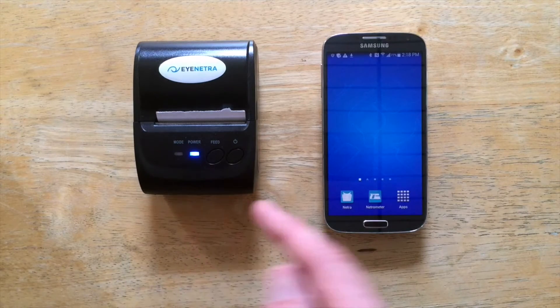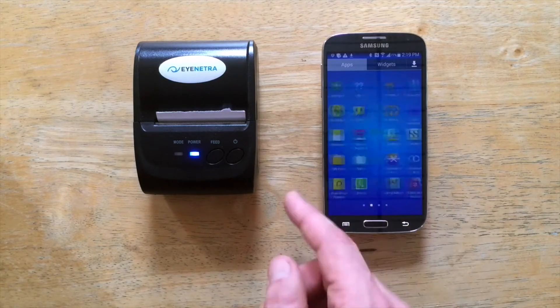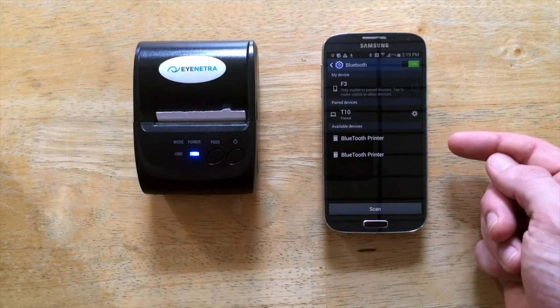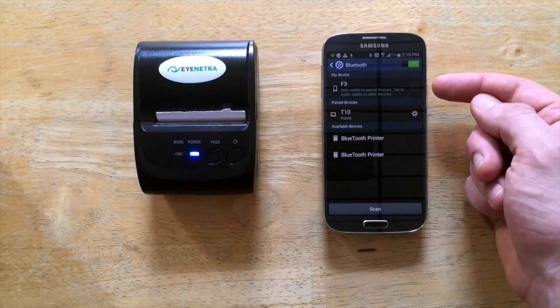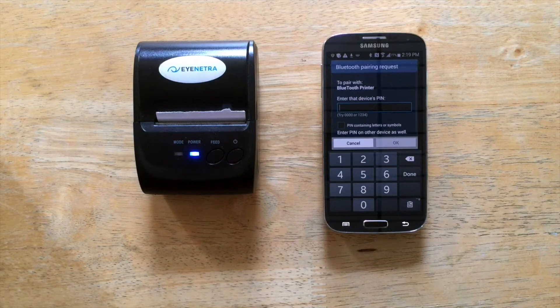Then we must pair the printer to the phone via Bluetooth. To do that, I'll simply select Apps, page over till I find Settings, select Bluetooth. And if your printer doesn't show up right away, you may check this box to make your phone visible to all nearby Bluetooth devices. So I will select Bluetooth printer and then simply follow the prompts.